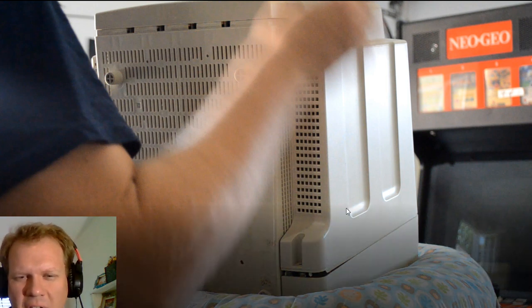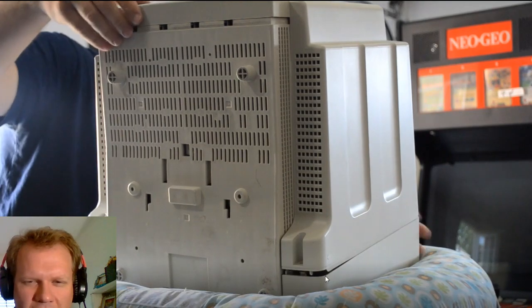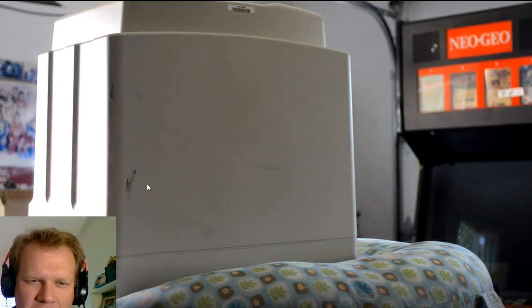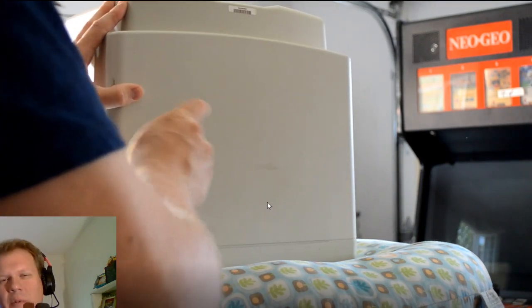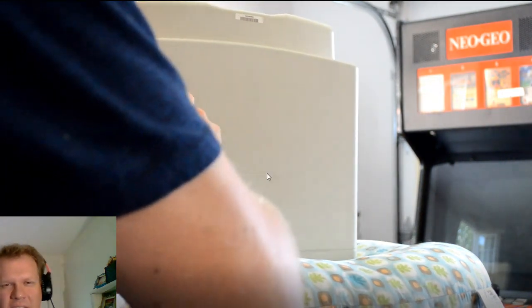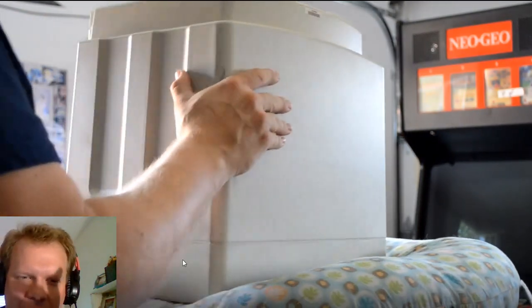So this shell on here is very tightly put together. You've got four screws, two, one on each side in this corner down here, and then two on the back of the monitor. But in the front of the monitor at the top of the actual plastic, I was not able to easily get this unhinged or opened, and I wanted to be careful. I didn't want to destroy the plastic on something that was this old. Again, 18-year-old plastic could easily crack, and that shell would be very hard to find.